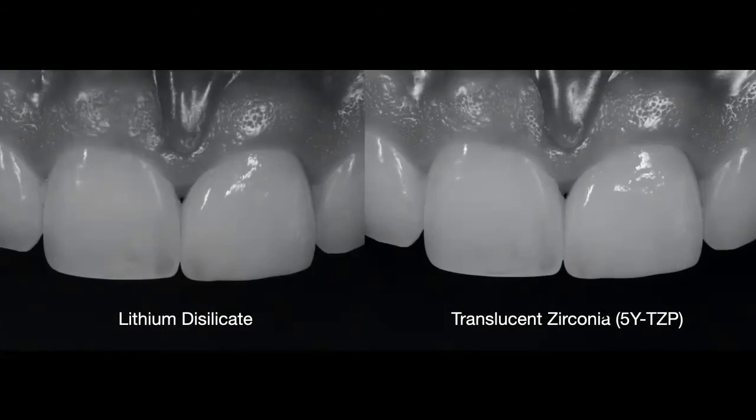So obviously, if you layer lithium disilicate or you cut back lithium disilicate on the incisal edge and you add a more translucent type of ceramic, you're going to get a more translucent effect. So that's just natural out of this material.